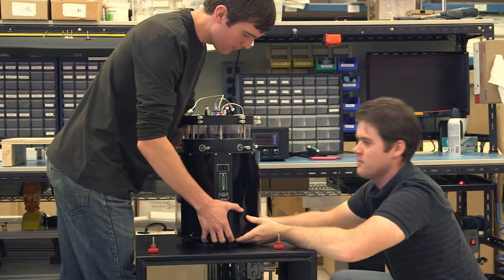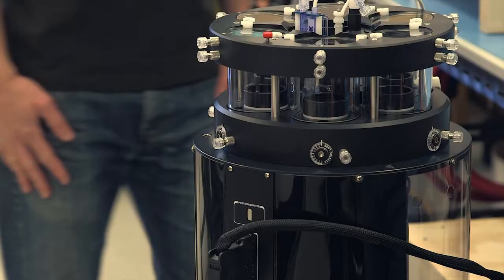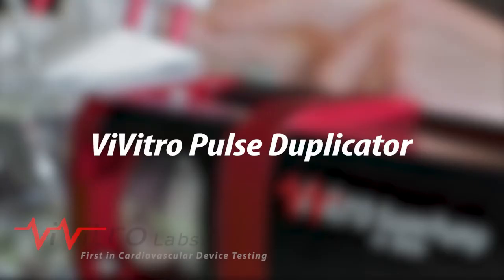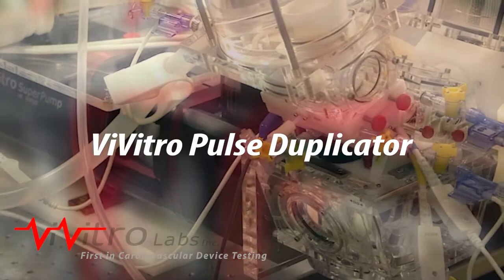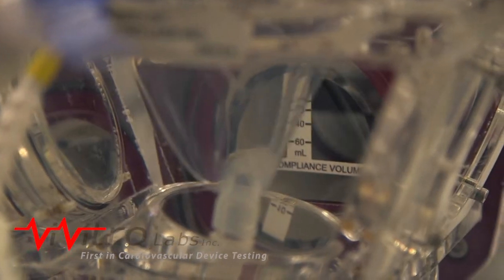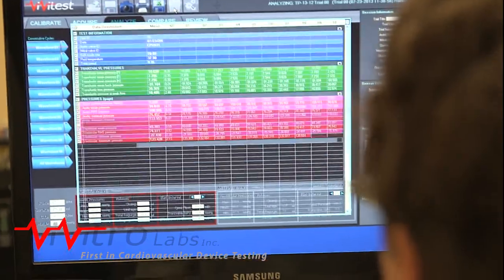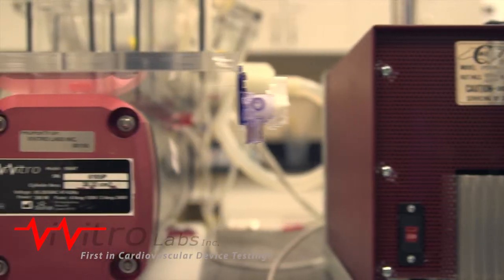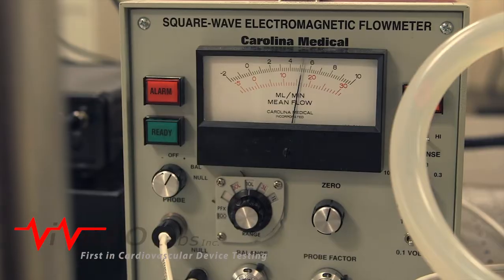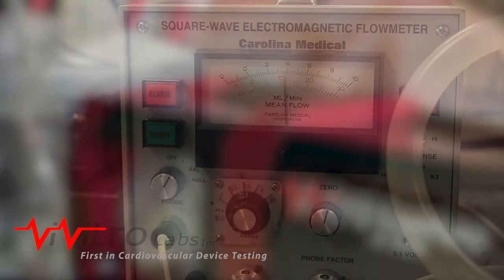All Vivitro products are manufactured by our parent company, Starfish Medical. The Vivitro pulse duplicator is the world's first and most widely used heart model. Composed of the Vivitro model left heart, super pump, and Vivitest data acquisition system, the components work together to enable hydrodynamic testing that determines valve performance and acts as a physiological heart model.